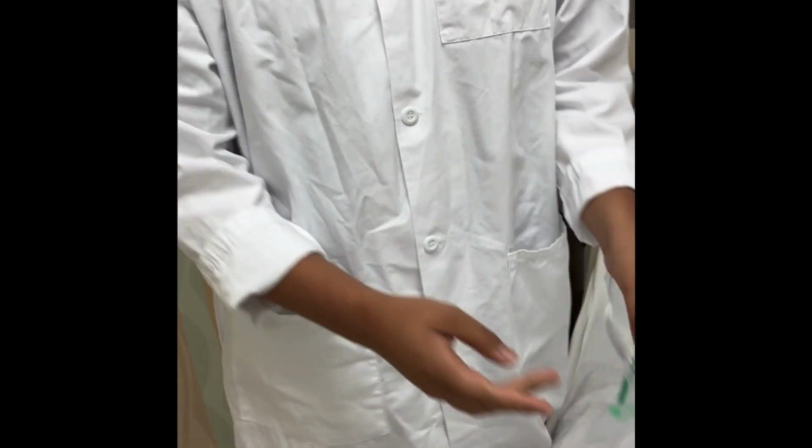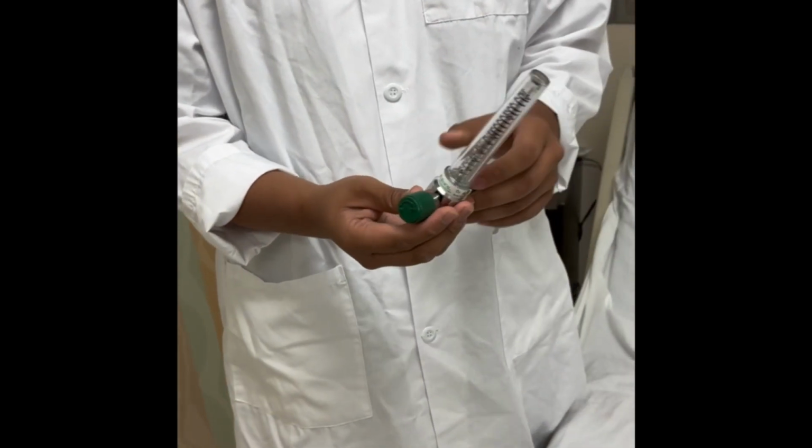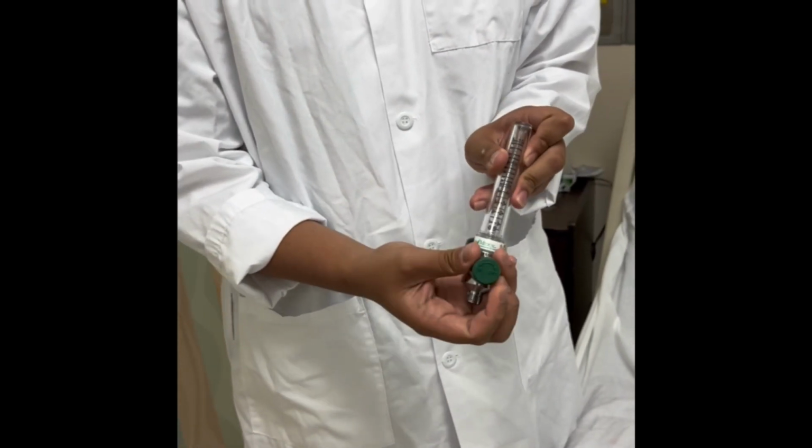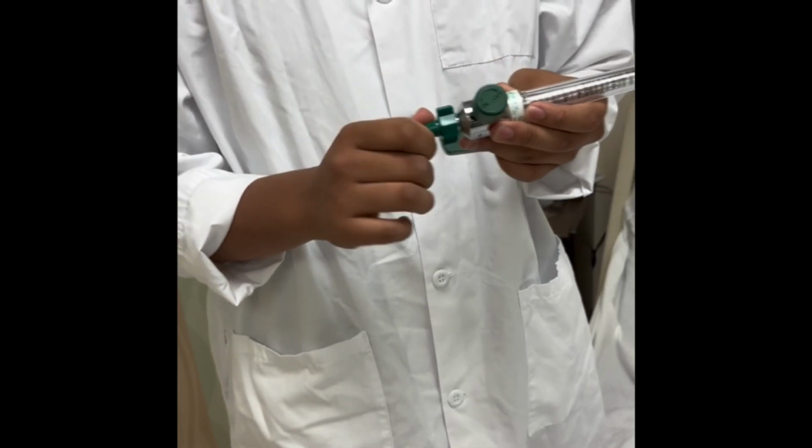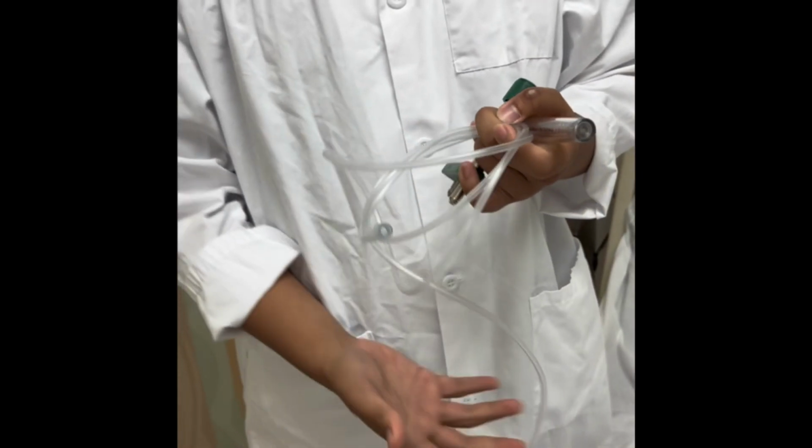Alright, and now we're going to need the flow meter, which is right here and measures the flow of oxygen delivery. And we also have the tree that goes onto the flow meter. And we have the oxygen line. Cool.